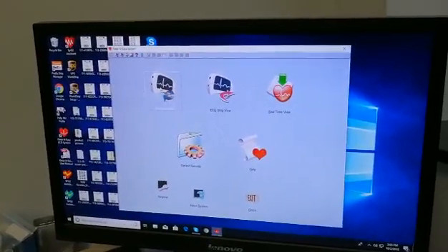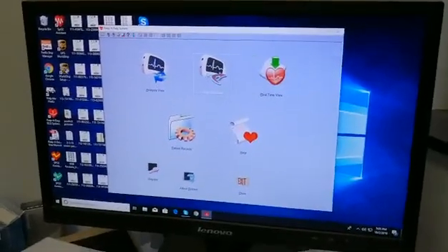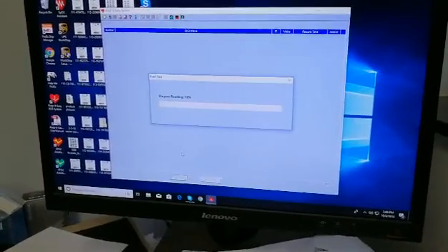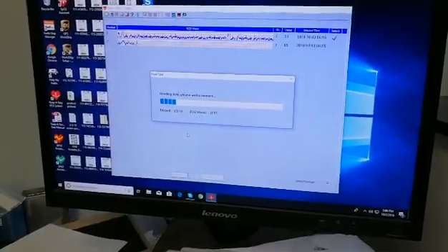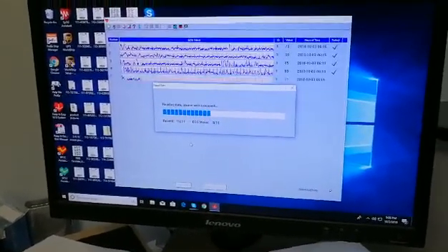With this cable connected, you can choose the ECG strip view, and then click the Read Data button at the bottom of the page, at which point the software will begin to run, and will transfer any recordings you have stored on the unit to the software for further detailed review.